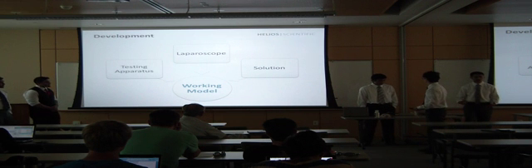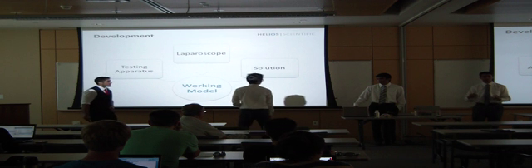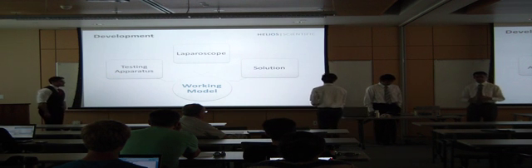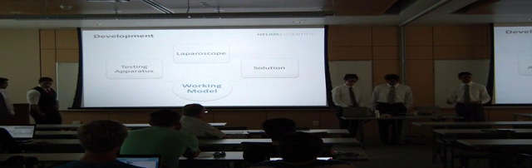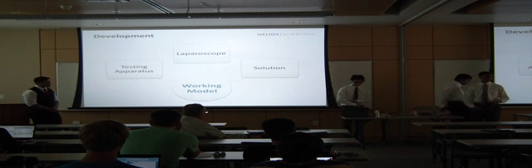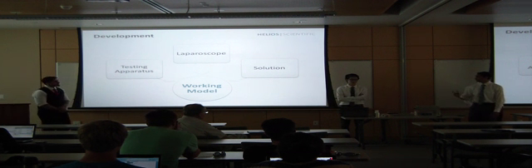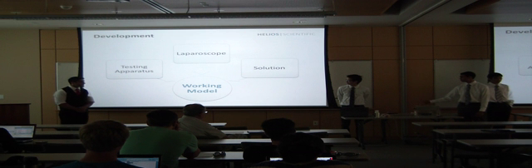So our project had three overall parts. The main one was building a solution that would prevent fogging and remove smudging. But before we could do that, we first needed a way to simulate the problem and cause the fogging. So we needed a testing apparatus. After we had a testing apparatus, we had to build a laparoscope, something to test. And once we had that, we could finally work on our solution.